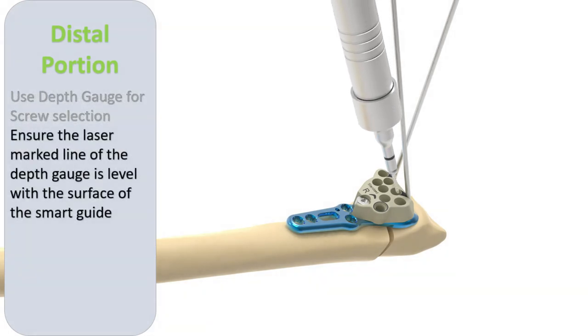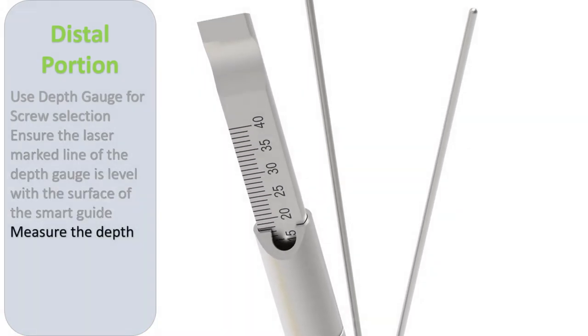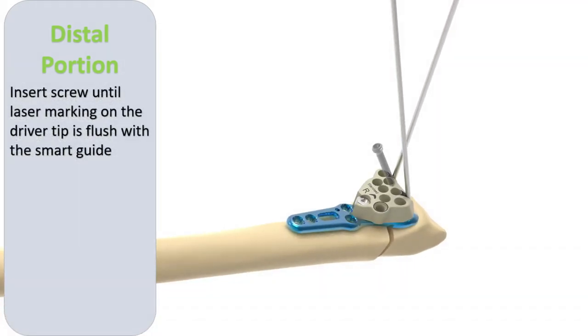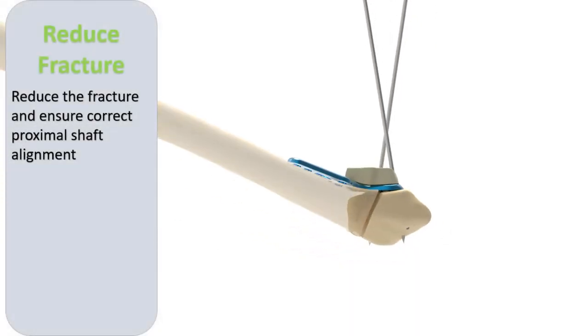Alternatively, the depth gauge can be used, again ensuring that the laser marked line of the depth gauge is level with the surface of the smart guide. An appropriate length of screw is then inserted, and the correct seating is ensured when the laser marking on the driver tip is flush with the smart guide. The correct shaft alignment is then ensured both visually and radiologically.